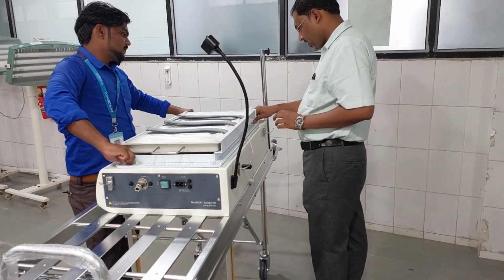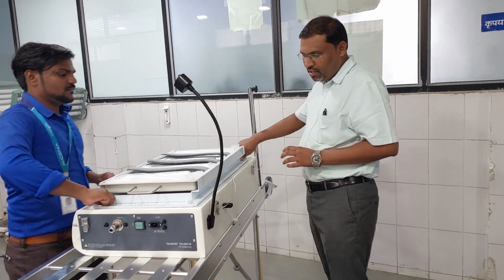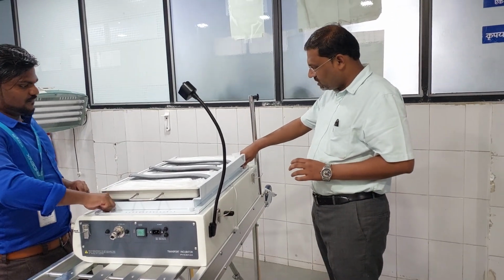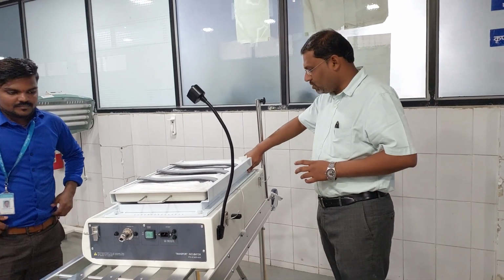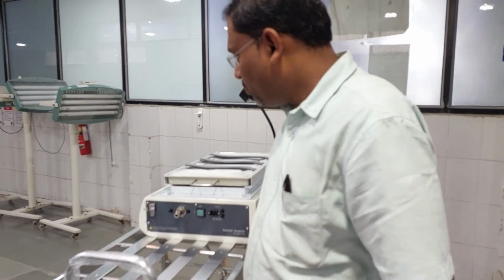So this is exactly the place where you are going to keep the baby. What is the use of this transport incubator? When some babies are serious and in the ICU, suppose they want to be transported to the OT and other places, for that we are using this shifting transport incubator.